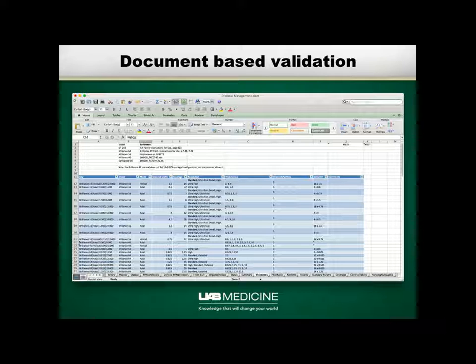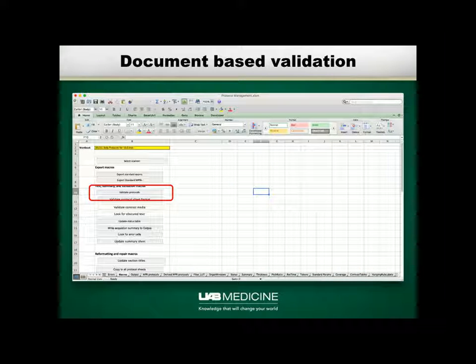It can't do 2.5 millimeter axial series. We've got to choose between 2 or 3. Those kinds of little differences are important when you're setting these protocols up. So you really need to know your scanners and the limitations on them. And it's a lot of information. It's good to have it recorded in a structured manner like this.